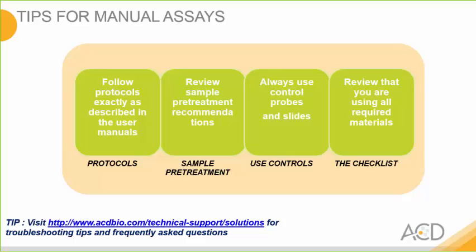First, be sure to select, as I mentioned, the appropriate user manual for your tissue type and your sample type. And we advise you to follow the protocol exactly as described. Follow the fixation conditions as closely as possible. And then next is to review sample pretreatment conditions for your specific tissue and assay type. And these are both critical for RNAscope assay success.